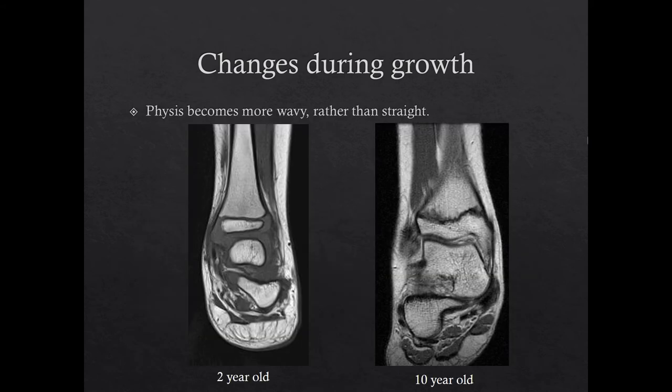The appearance of the physis may also change during growth. For example, the distal tibial physis initially has a straight contour, as seen here in this 2-year-old. During growth, the distal tibial physis develops an undulating, wavy contour, which can be seen on both plain film and MRI, as in this 10-year-old. The prominent anteromedial superior extension of the physis in the distal tibia has also been referred to as Kump's bump on a plain film.